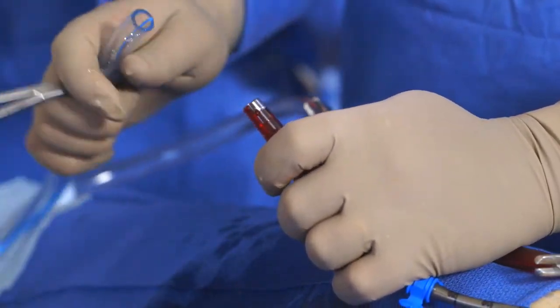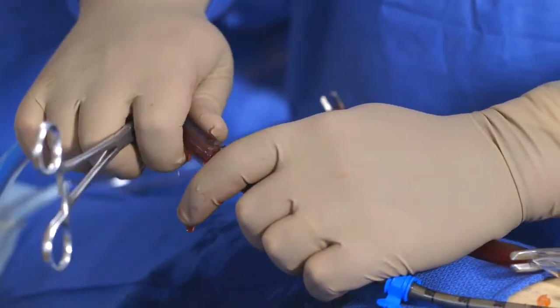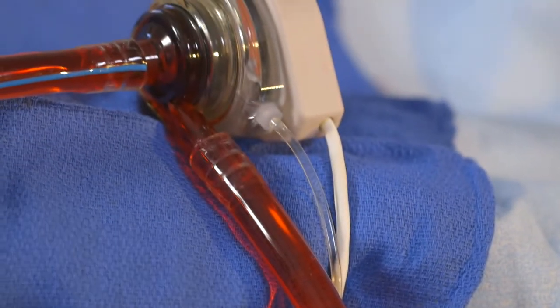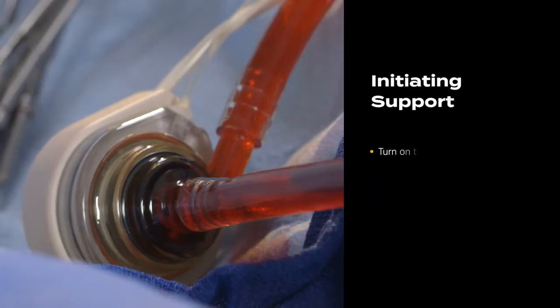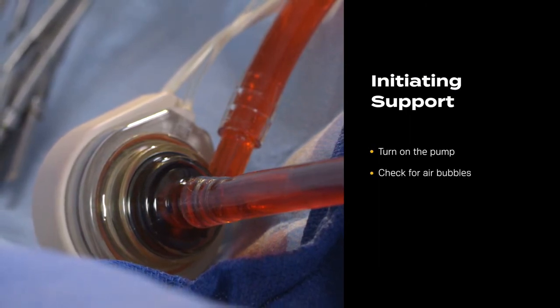Connect the pump inflow tubing marked with a blue stripe to the transeptal cannula using a wet-to-wet connection. Once again, inspect the pump and tubings for air. Turn on the pump, which will start at 5500 rpm. Check for air bubbles.